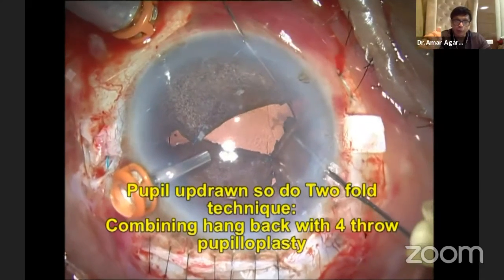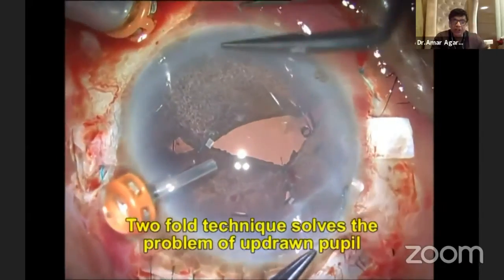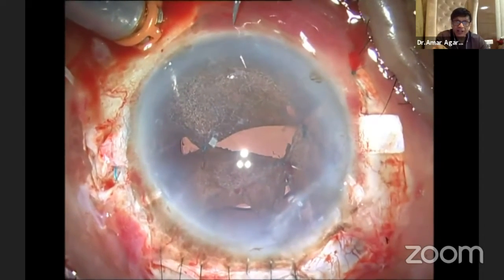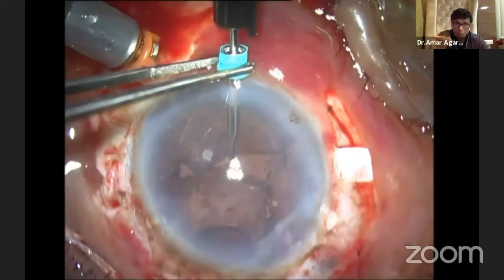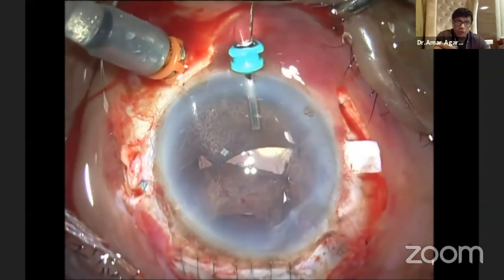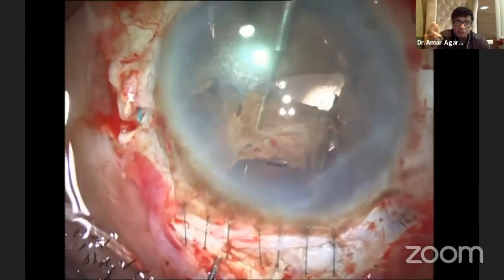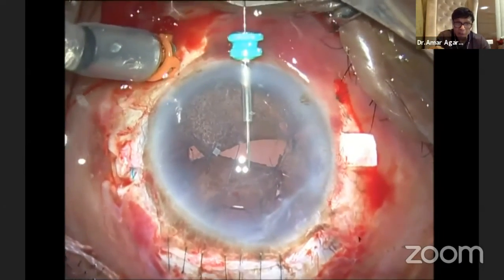That means you combine this again with a four-throw pupilloplasty and make that pupil back to normal. Here you can see I'm again doing the four-throw pupilloplasty, making that pupil back to normal. Now look at the one on top, superiorly — there's a huge iridodialysis there. So I have to solve that iridodialysis. If you do a simple hangback without a trocar, from 6 o'clock to 12 o'clock to reach is very tough. With the trocar, the game becomes extremely easy — the trocar guides the needle, which was a great surprise to me. I use a 30-gauge needle, railroad it, bring it out, and bring the other arm through the iris.